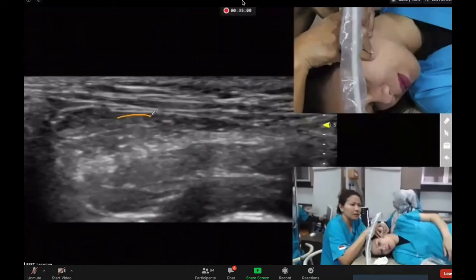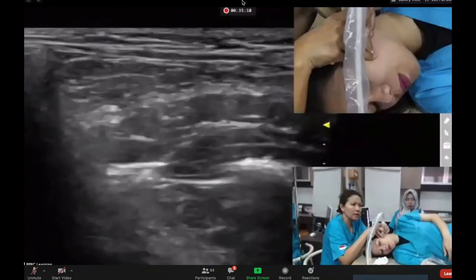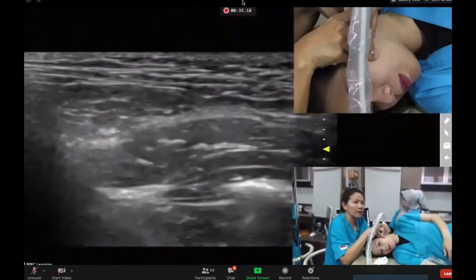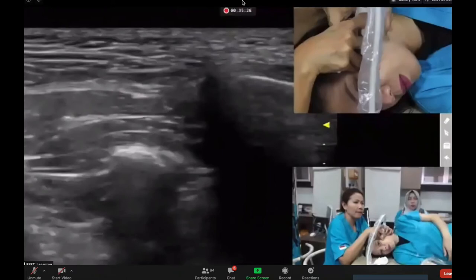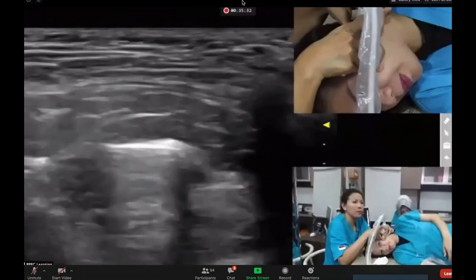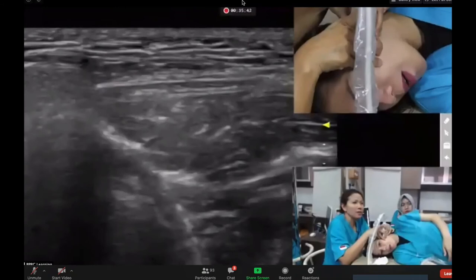joint. Okay, freeze it, please. Wait, unfreeze. Increase the depth, please. 20. Okay. No. Increase the depth. 25. Open your mouth. Close. Open your mouth. Okay, close again. Here. Open the mouth. Close the mouth. Okay. Review, please.